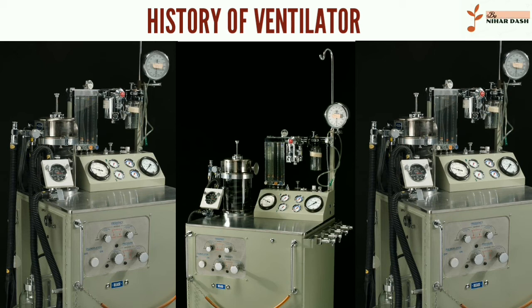Electric motors were, however, a problem in the operating theaters of that time, as their use caused an explosion hazard in the presence of flammable anesthetics such as ether and cyclopropane. In 1952, Roger Manley of the Westminster Hospital, London, developed a ventilator which was entirely gas-driven and became the most popular model used in Europe.